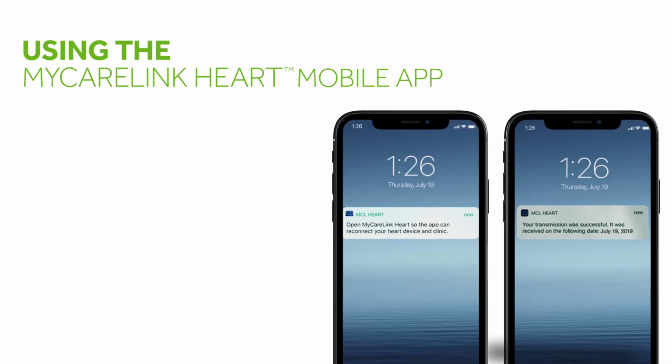Like other apps you may use, MyCareLink Heart can send you automatic notifications through the app, by email or by text message, to help you stay connected to your clinic and let you know when your transmissions are received.